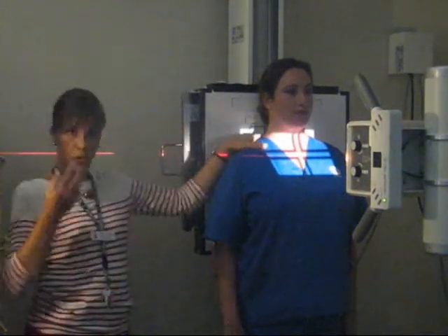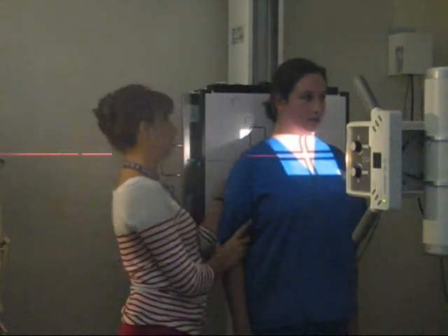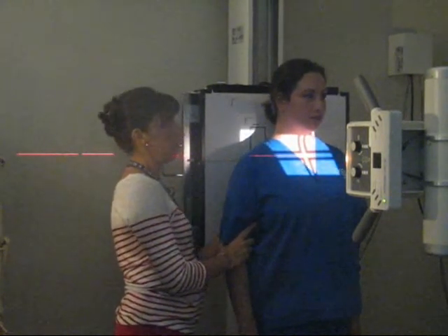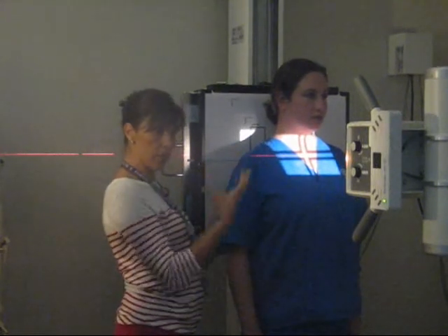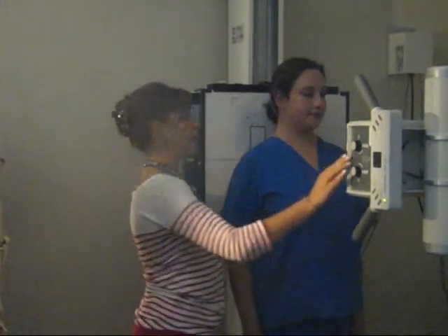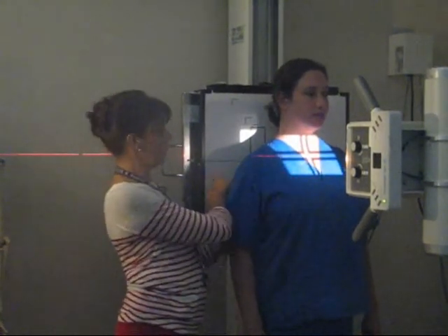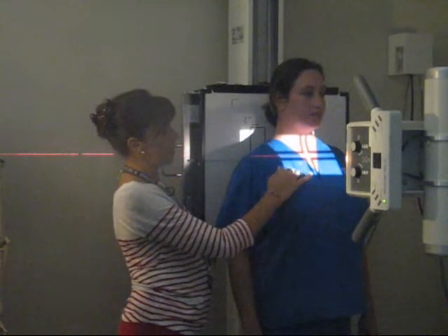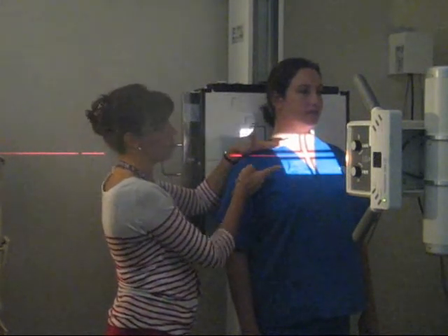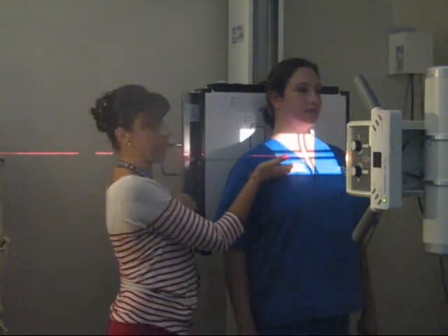If you have a hard time trying to visualize where the scapula is, bring your patient away from the board a little and kind of bring your hand and feel for the scapula, okay? And you can feel it kind of triangles to the bottom. So feel it around and find its midway point, and then try to bring it around to the front of the body with your eyes, okay? Middle of your scapula is probably going to be a point midway between the top of the shoulder and the nipple line. Okay, so your CR is going to want to be about there.